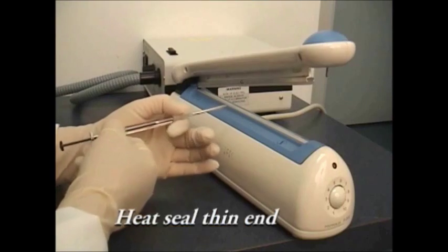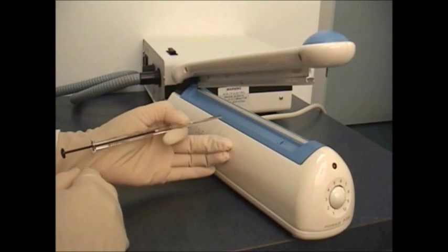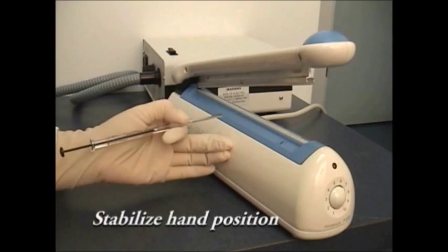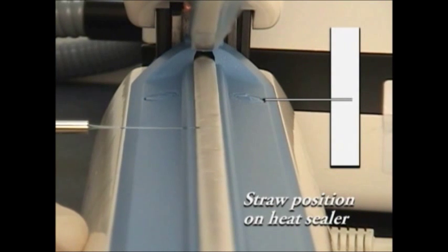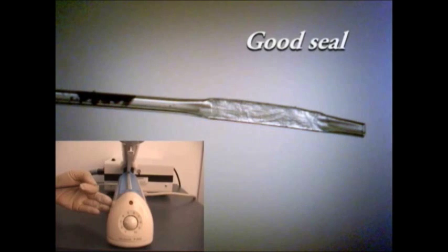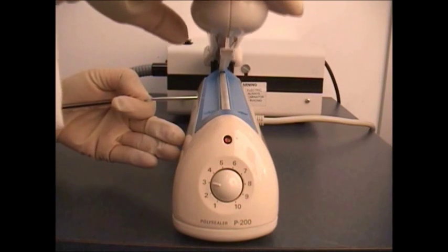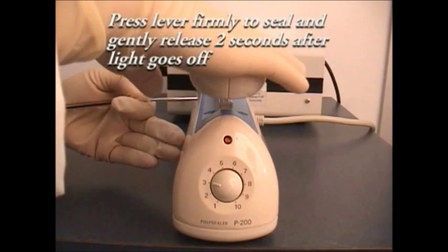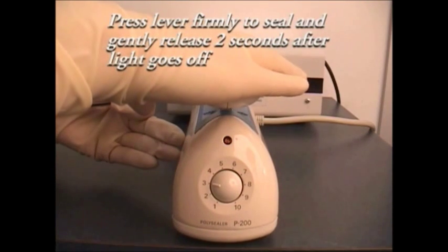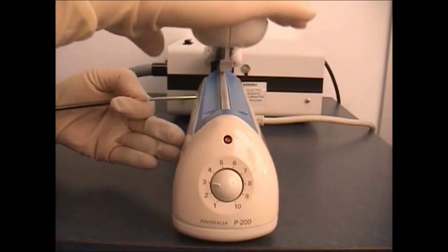Next, the thin end of the cryo tip is heat sealed followed by checking the seal under the microscope to confirm that the seal is good and is not broken. Then the stillet is pulled back and the thick side of the cryo tip is heat sealed in a similar fashion.